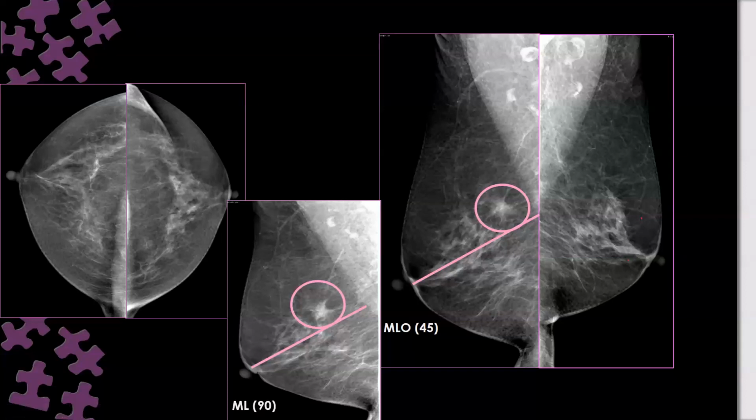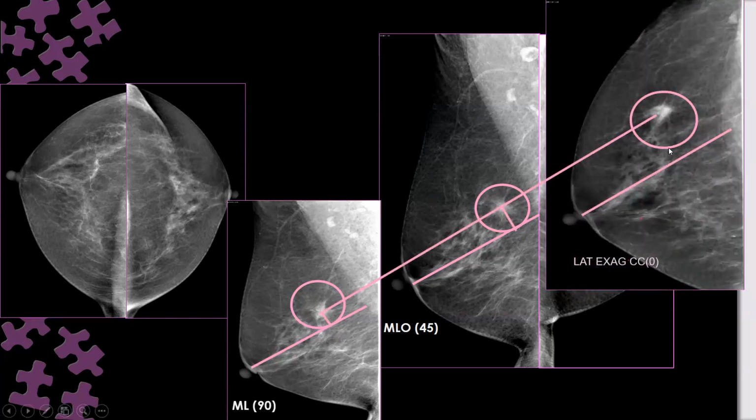So, expected to be... Yes, here is the extended lateral view, you can see it. In the MLO it is at a higher level, in the straight lateral it is lower, and when we did the extended lateral it is very clear. But if you wanted to convince me from the CC view, you would say medially: I could see the breast up to the middle of the medial aspect, up to the pectoralis. The posterior breast is 100% included in the medial but not on the lateral.